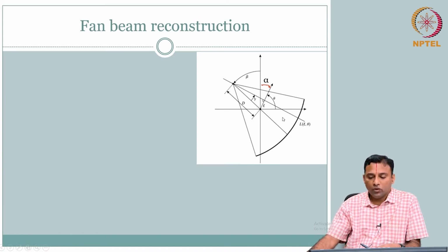So we'll come to that. Then you have to place your sources, how much distance it is from this center. So that is capital D. So we can define this L, and this is an angle. We'll talk about this alpha. Alpha is nothing but this angle, right? What this perpendicular is making with respect to the vertical.